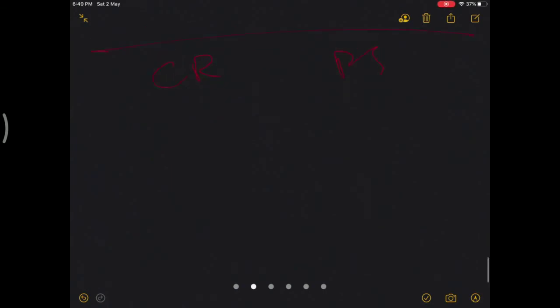So we know that since we are retaining the cruciate, we need not take a cut which accommodates the cam post mechanism. So in PS, as you know, you will have to accommodate the cam post mechanism. So you will take some amount of distal femur cut as a third condyle and make a box which allows for the cam and the post.